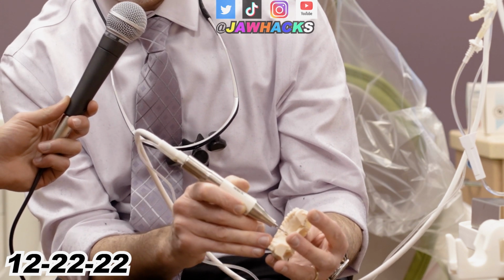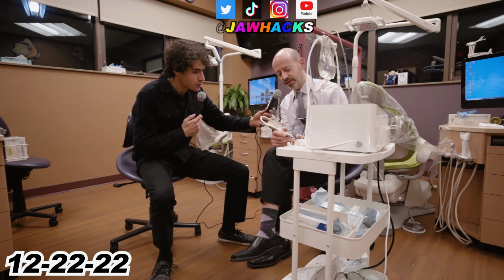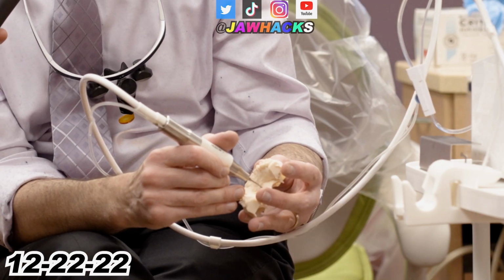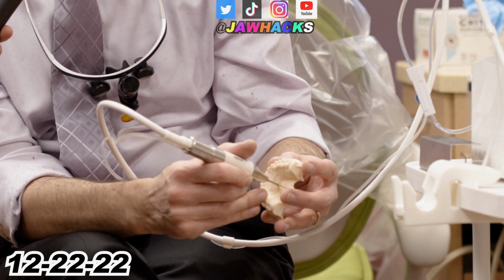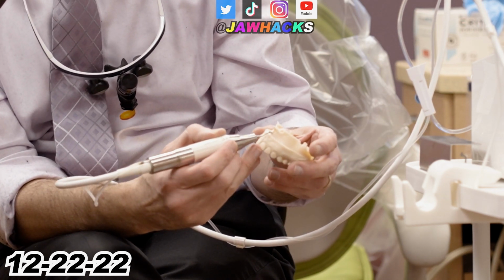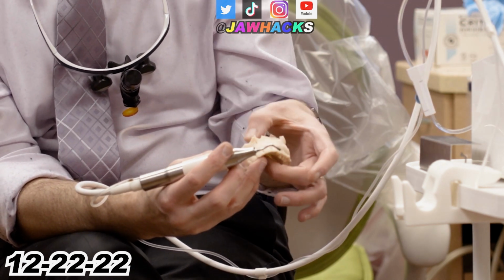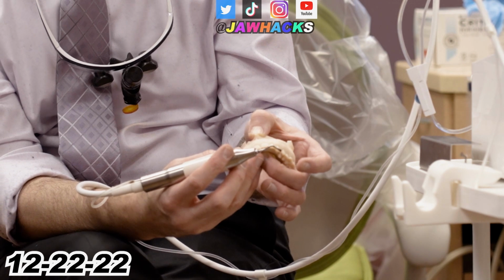And then you go down this way. You're holding it like a pen, so it's a delicate procedure. The tool does all the work. That's pretty much it, yes. There's no pressure. So you essentially just go just like this, and then you go above the teeth, straight into the nasal spine, essentially releasing where the biggest resistance to the expansion is.